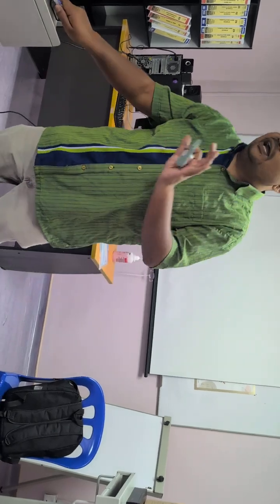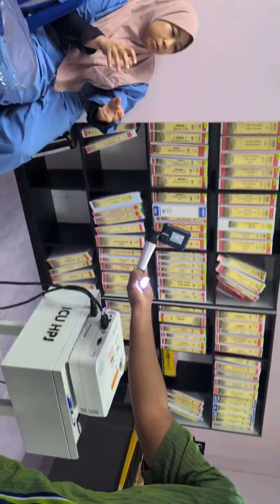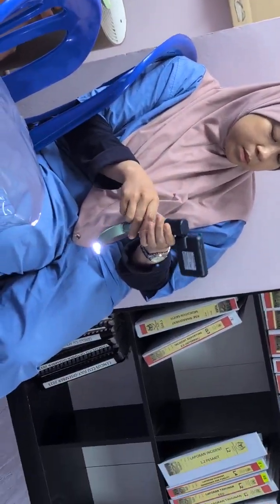You know? So, advantages and disadvantages. Have a look at it, play around. What material is this? Apa dia? Titanium. Titanium. Titanium.